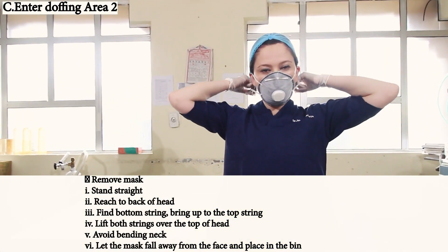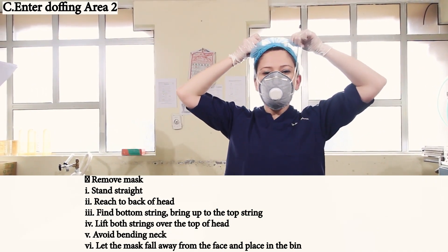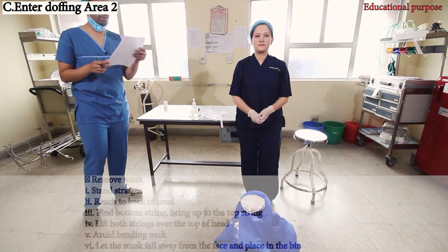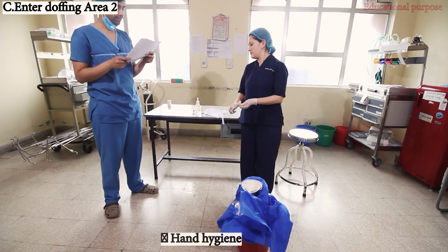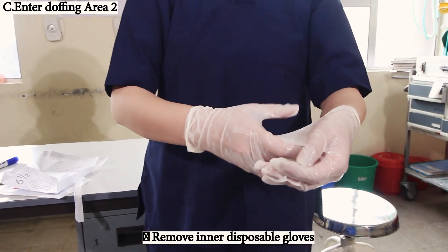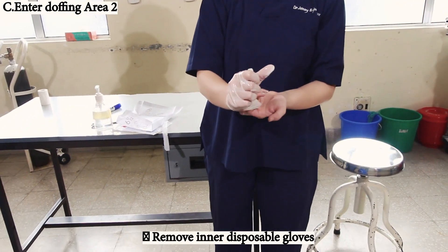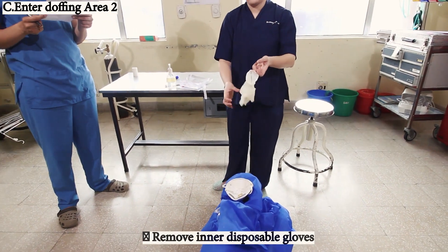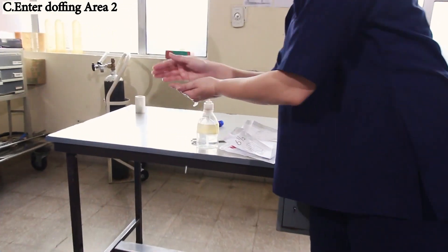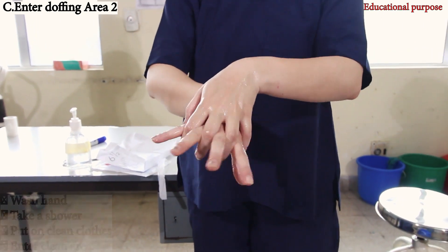Hand hygiene again. Remove the goggles if used. Remove the mask after hand hygiene: reach to the back, find the bottom string first and bring it off, then the top string. Lift both strings over the head and let the mask fall away from the face. Place it in the bin. Hand hygiene again, remove the inner disposable gloves, perform hand hygiene again, and leave Area 2. Subsequently, wash hands, take a shower, put on clean clothes, and enter the clean area.